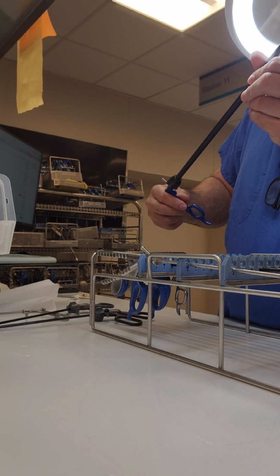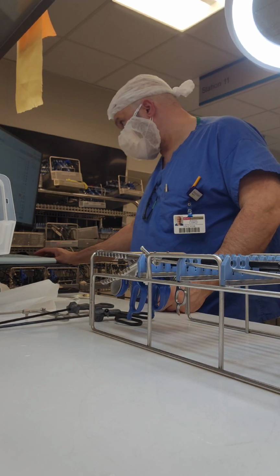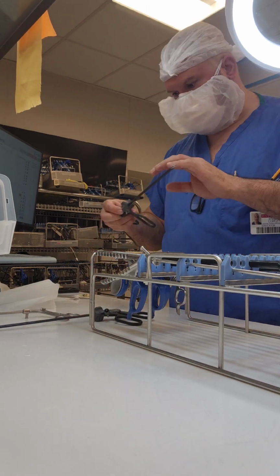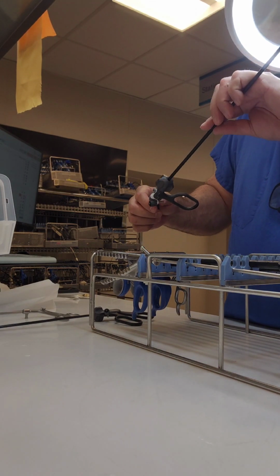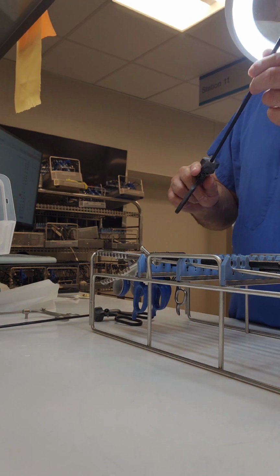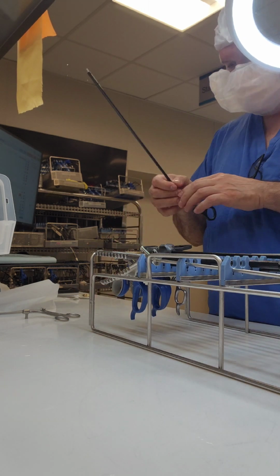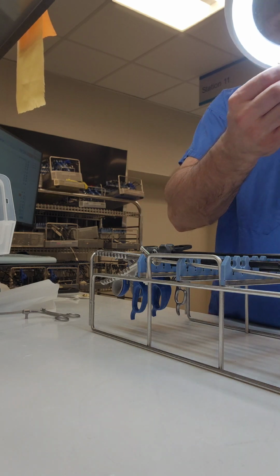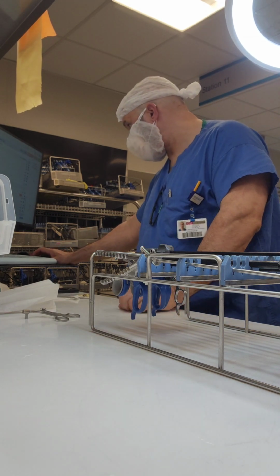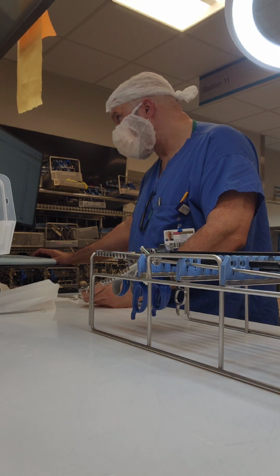Now, this instrument I had to get from the backup wall because the one that I had in the set was damaged. Okay, checking it off on the count sheet again. Okay, I'm getting down to the wire here. Now, some of the instruments had no place on this rack. I couldn't find a spot for it, so I had to sit it on top like so. And you'll see later on when I try to box this instrument set up that I had to do some arrangements. So, all right, all of my instruments are on the rack there.